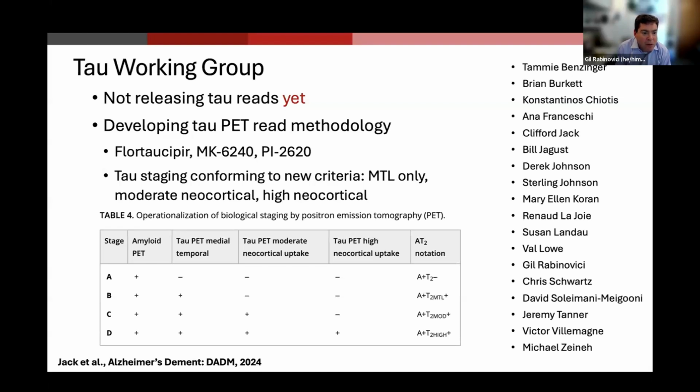And in returning the results, remember that in the new Alzheimer's Association diagnostic criteria, tau PET is the primary biomarker that allows you to do biomarker staging of disease progression in people with Alzheimer's disease.